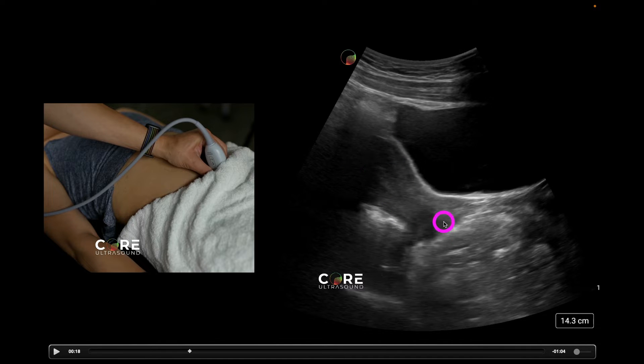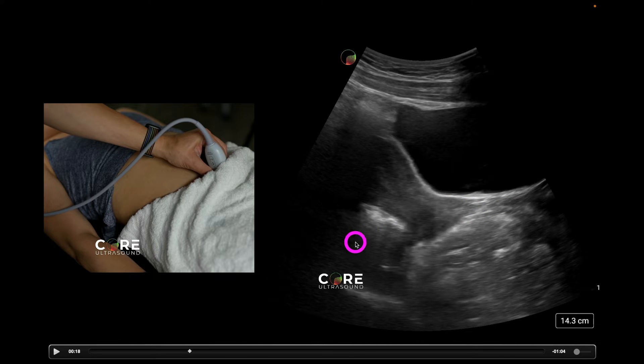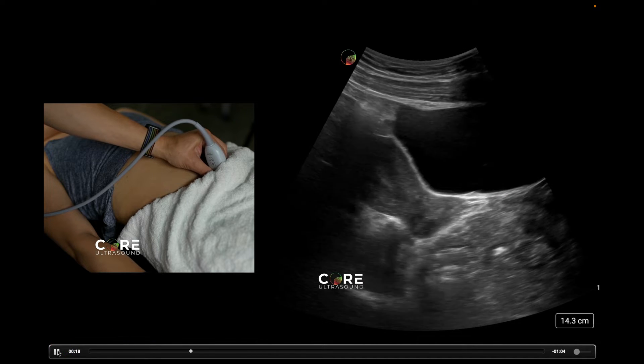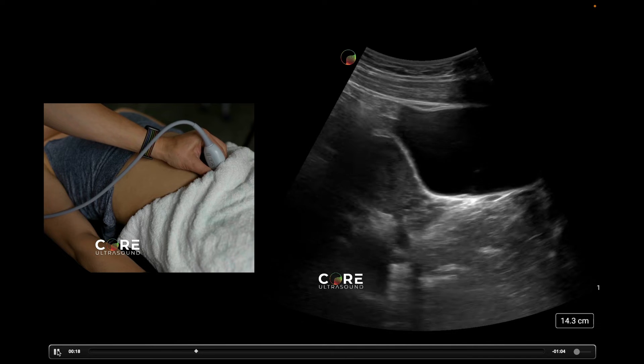Now we're actually able to see a lot more of that uterus. This is the uterus. Down here we have the cervix, and then we have the vaginal canal over here, and then back here we have the pouch of Douglas.